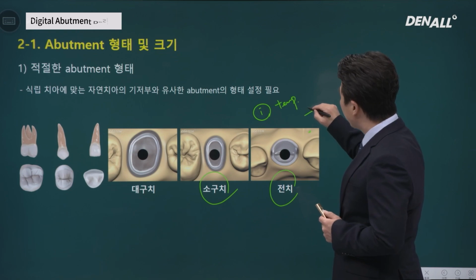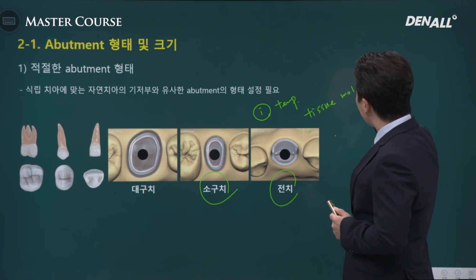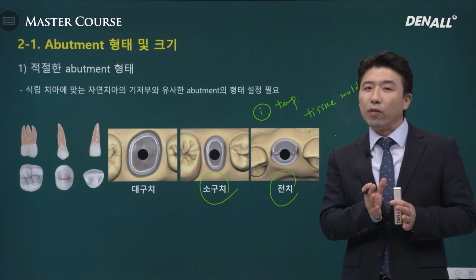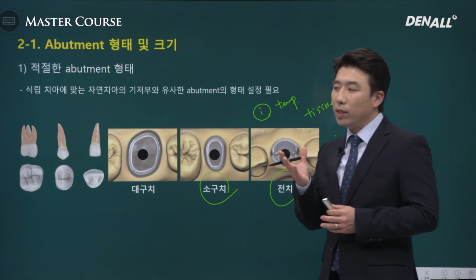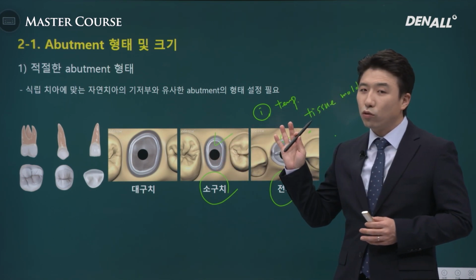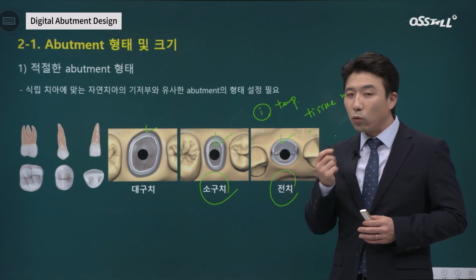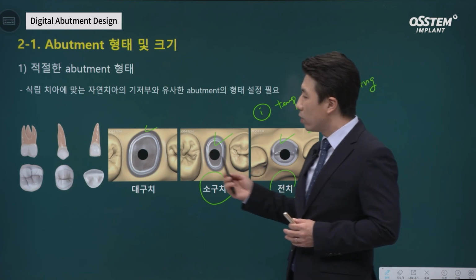We adjust the gingival form. Provisionals are adjusted to form the desired gingival profile. The impression is taken and the final design is done. Tissue molding in the anterior zone is very essential. In the case of a molar area, it is not as essential, but for smooth oral hygiene and for the aesthetic factor, we need to find the right profile.